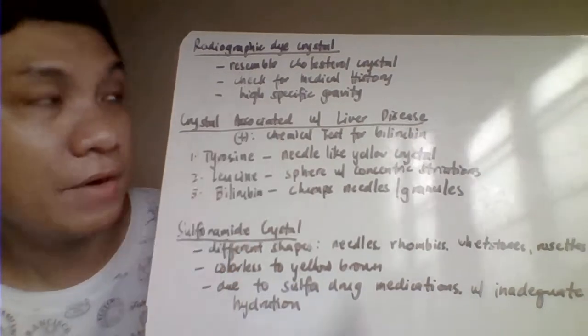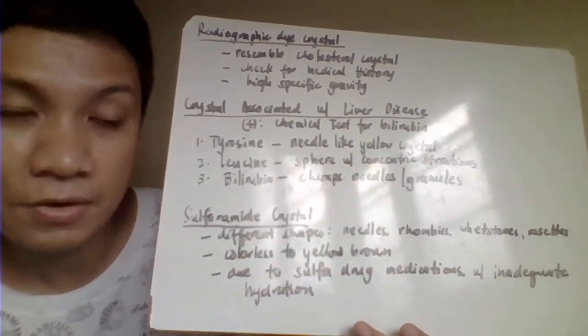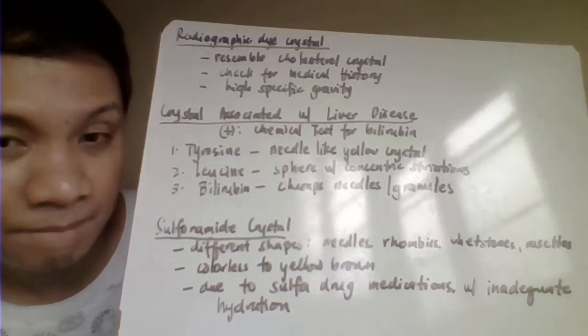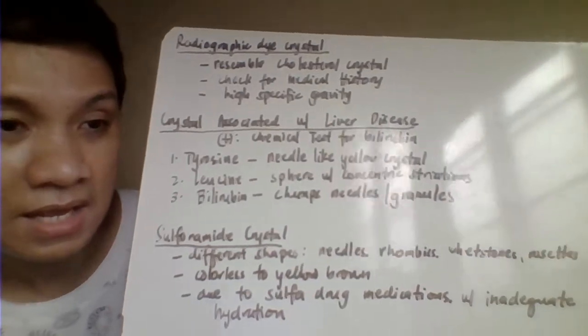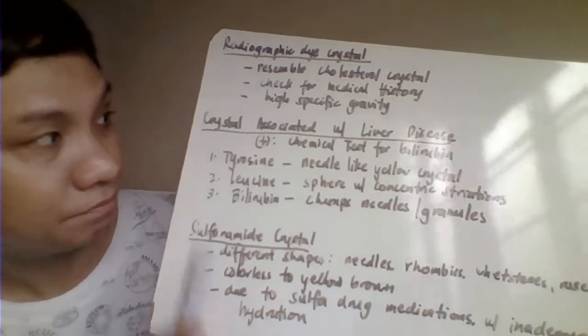Usually for radiographic dye crystals, it means the patient has undergone a radiographic procedure, X-ray procedures where they were given radiographic contrast media. At the same time, they can also be identified as having a high specific gravity. That would differentiate them from your cholesterol crystals.